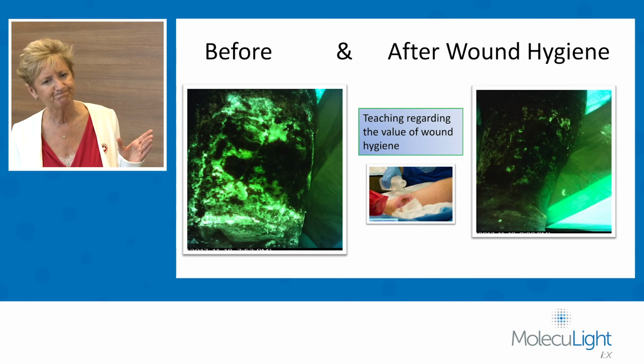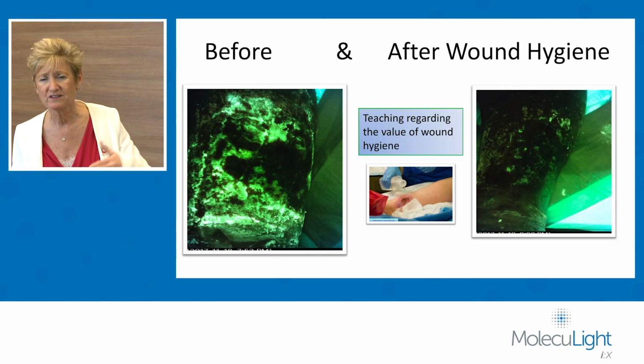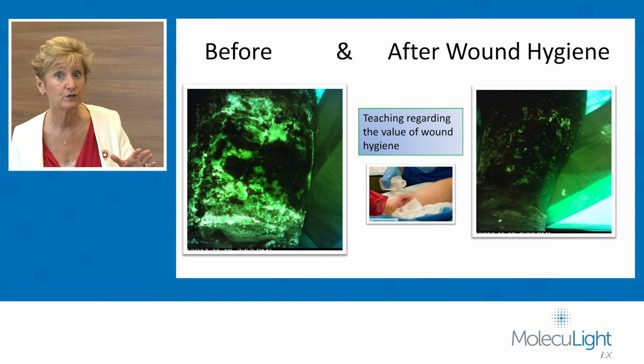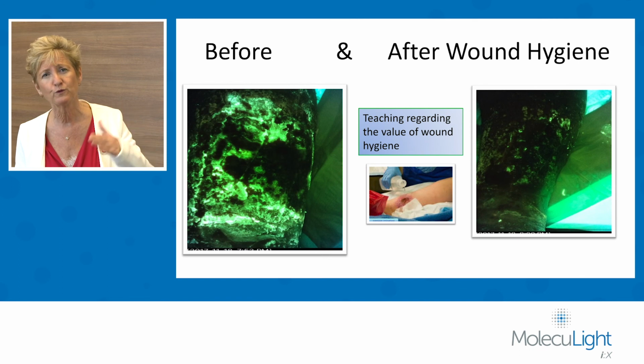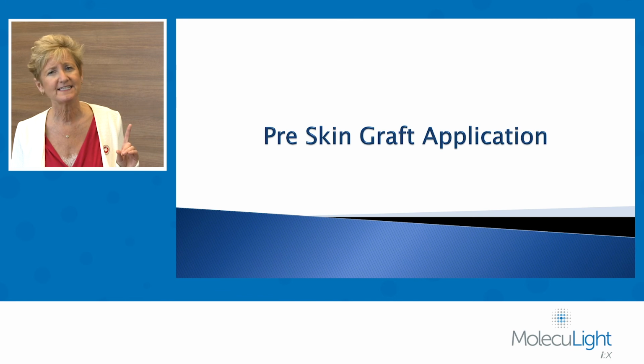And so I said, we're looking at your wound and I can see there's Pseudomonas there. So I'd like to take the opportunity to cleanse your wound, and I'll be careful because I know it's tender, but I just want to show you the difference in terms of wound cleansing. And then we'll re-image your leg. And it's fascinating to see the difference of proper wound hygiene, and there's a satisfaction of eliminating some of that superficial and peri-wound Pseudomonas.